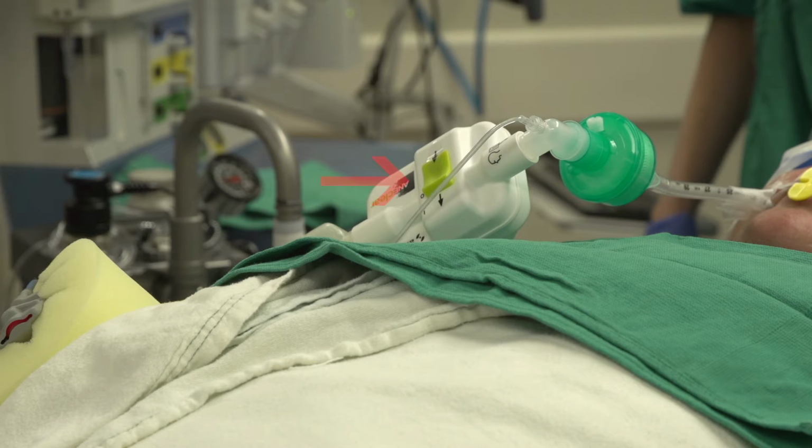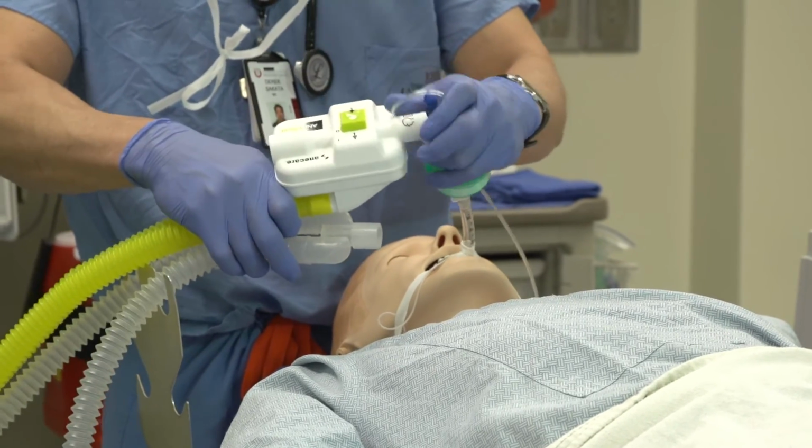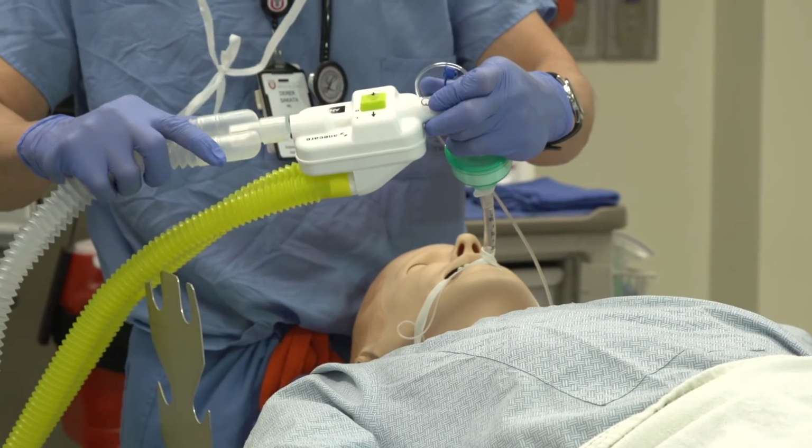ANEclear is designed with an activation switch so that it can be inserted into the breathing circuit at any time prior to emerging the patient. When deactivated, ANEclear is in bypass mode, adding only 8.5 milliliters of dead space into your breathing circuit. If applicable and desired, this bypass mode allows for ANEclear insertion prior to surgical draping. Premature activation of ANEclear during surgery may lead to emergence prior to surgical conclusion.